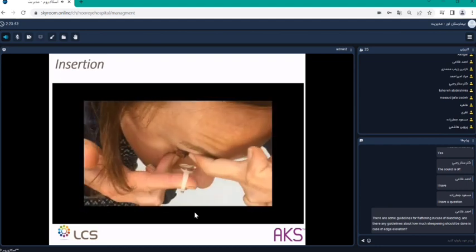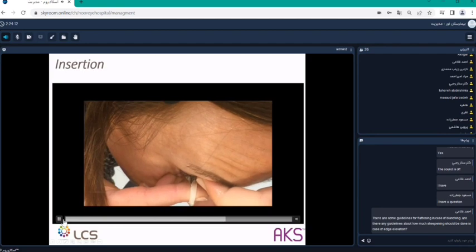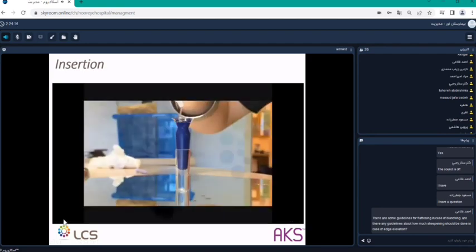So here you see the interest of the ring. For some patients who cannot use the suction holder, I have seen some patients who have just one finger. They have lost the other fingers. I mean, that happens, and so that can be useful. So we have manufactured that for some patients. That works for sclerals and also for some hybrid lenses. It is the same, it is inserted full filled.